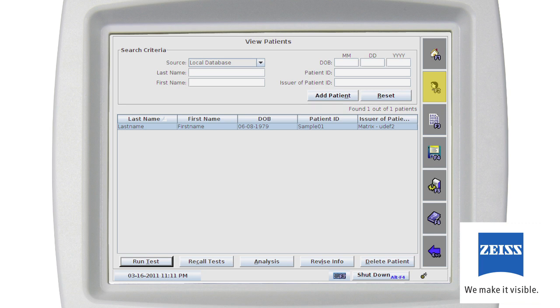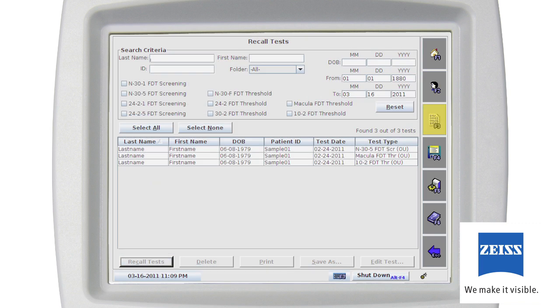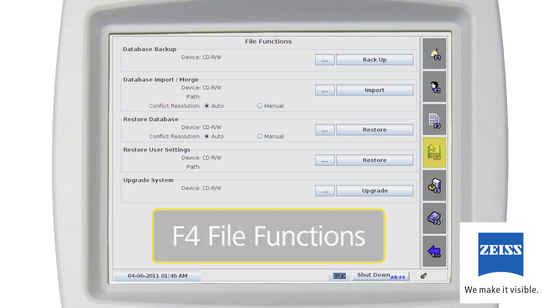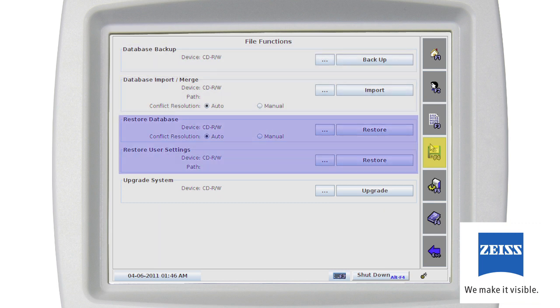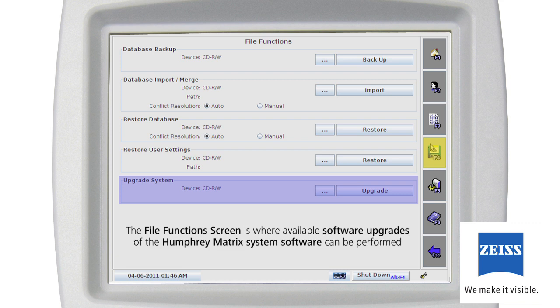If you have DICOM gateway enabled and are connected to a modality worklist provider, you can import patient demographic and scheduled exam information from a worklist. The Recall Test screen, F3, is where individual tests in the database are searched by patient or test information. The File Functions screen, F4, is where the patient test database is backed up, imported, merged, or restored. User settings can also be restored from a database backup, and available software upgrades of the Humphrey Matrix system software can be performed here.